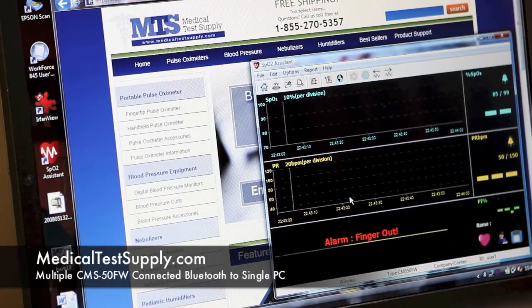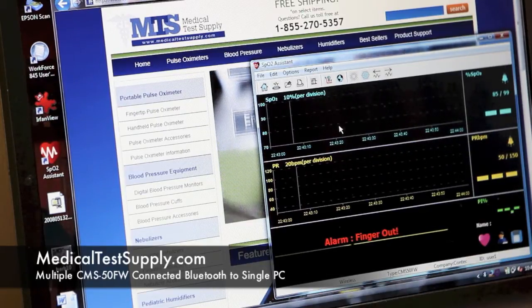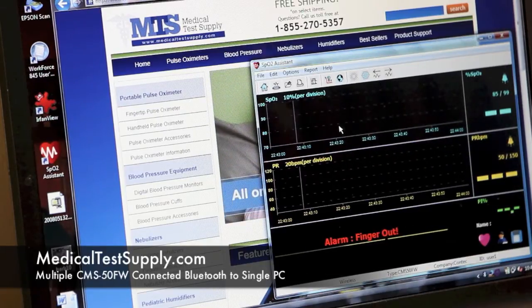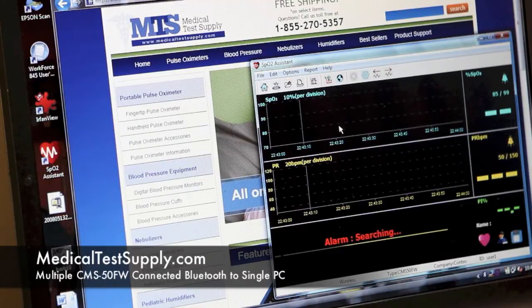We've got finger out data there. We can slide that on here and we'll start gathering data while we connect the others.